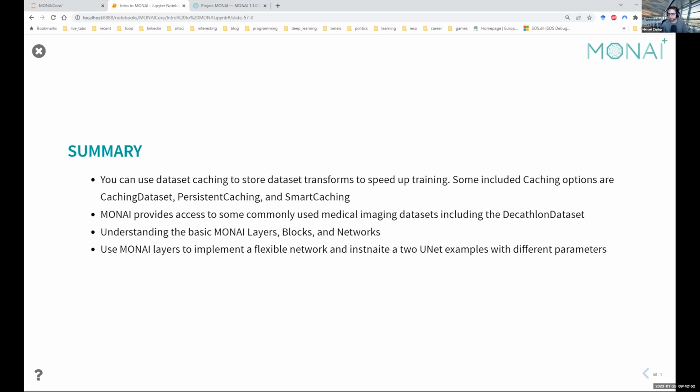Yeah, there were a few ones from up above that we can just go through really quickly here. Start at this one. If a transform function that we pass to a data set needs access to a parameter or metadata, how should we pass them? For example, doing a padding if the size of the image is below a threshold.